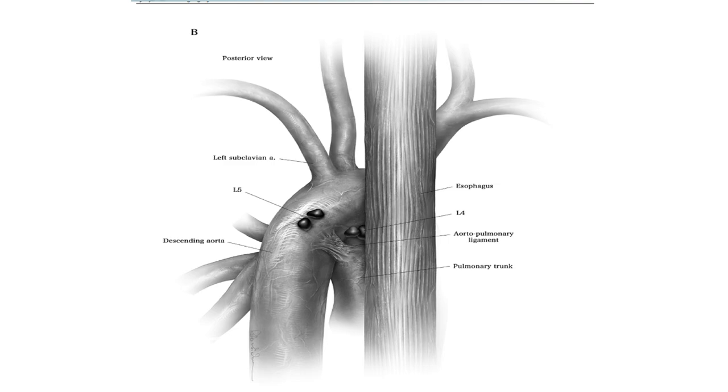But later on, our group from Montreal published a series of 100 patients where they did transvascular puncture of AP window lymph nodes, with no complications, and the diagnostic yield was somewhere in the 80%. AP window lymph nodes can be biopsied with and without traversing the aorta. I'll show you a video later in the presentation.